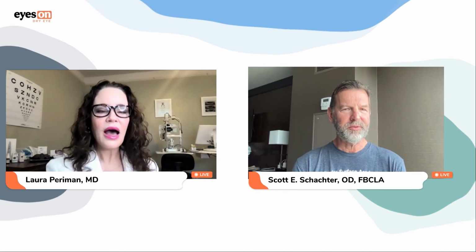I have the Goldmann. Do you have the Goldmann attachment for yours as well? I did get that. Yep. So I could check IOPs. Yep. Right. So it's a very easy to use slit lamp. It's high quality imaging. Again, these are billable.